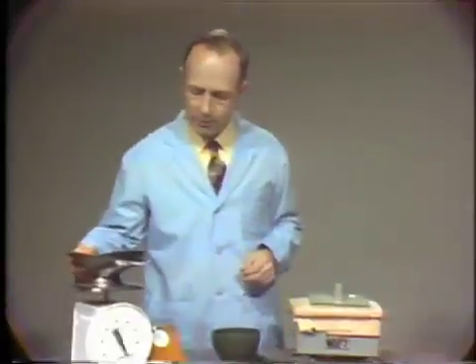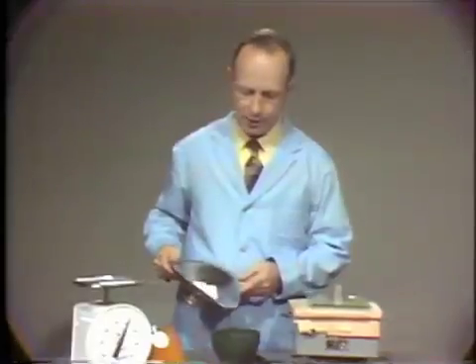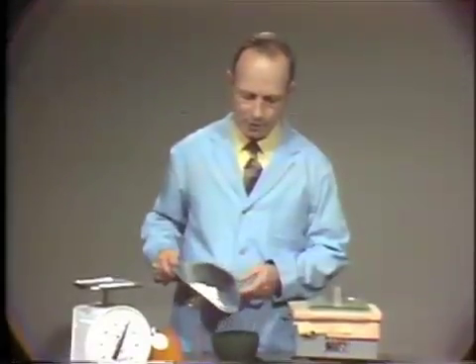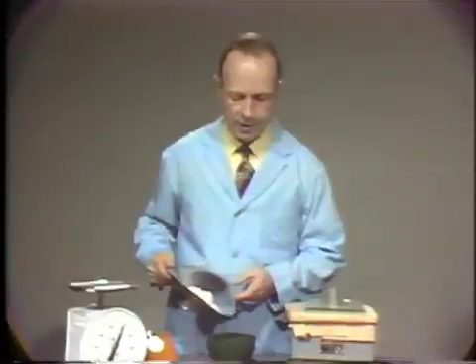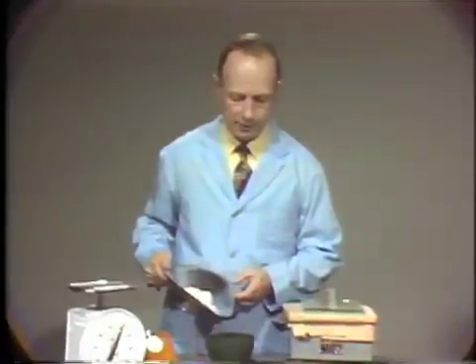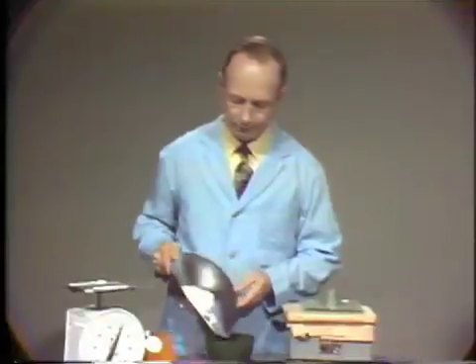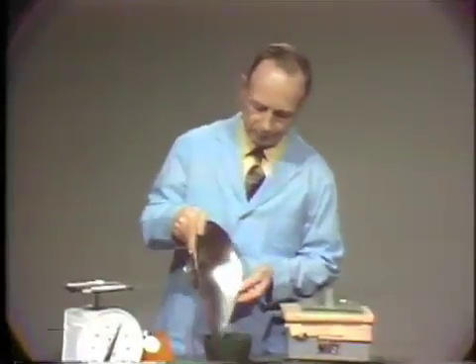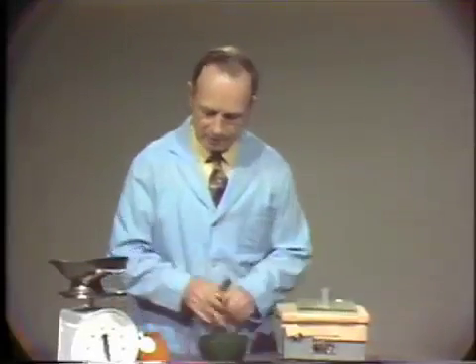We will mix this pre-weighed 50 grams of model plaster and we pour it into the water. This is done to avoid trapping air in the material rather than doing the reverse procedure of pouring the water into the powder.